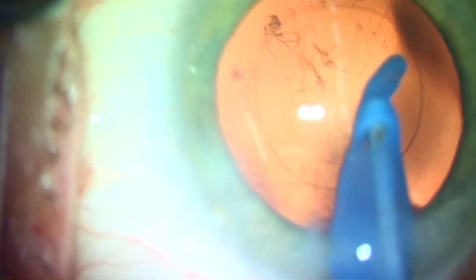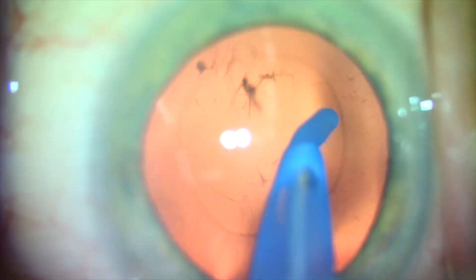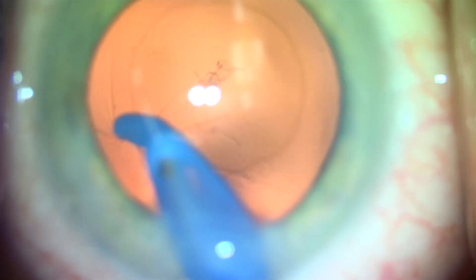Over the past year, we've been using the CapsuleGuard, which is a single-use irrigation and aspiration instrument, as our go-to device. The CapsuleGuard is the most capsule-friendly I&A device that I have used in my career.